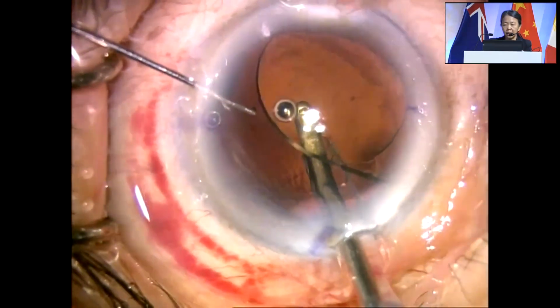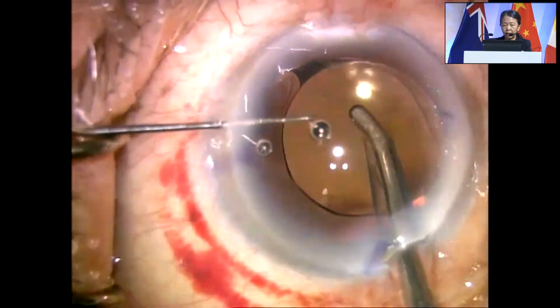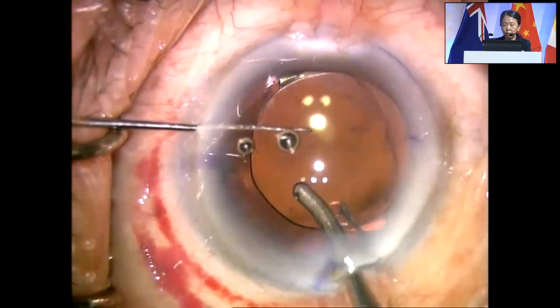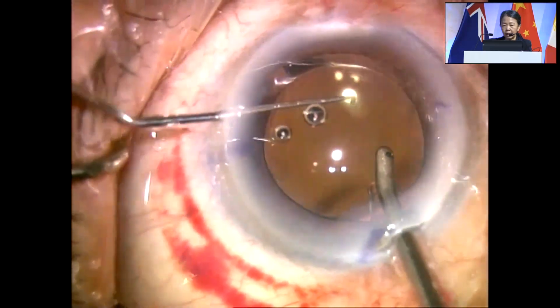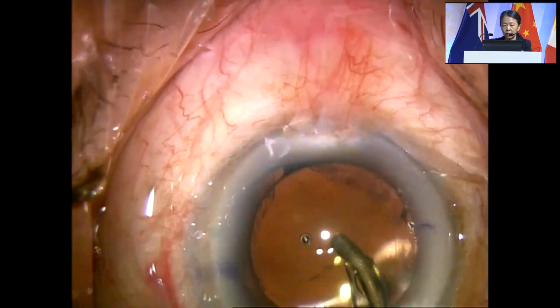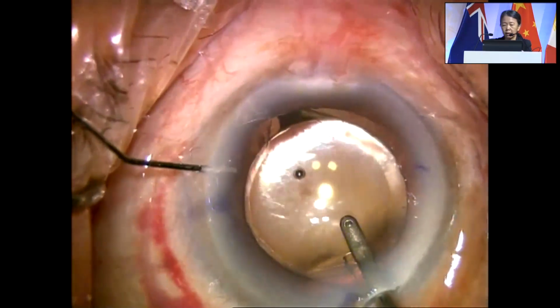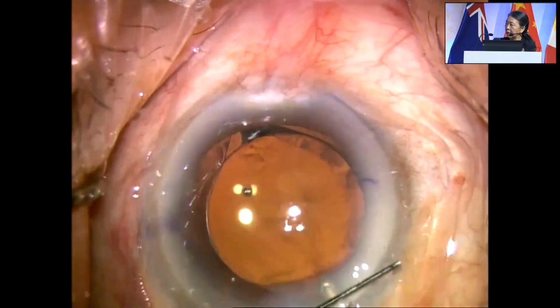I do think it does depend on your haptic design, but I have used the Alcon platform for many years in my practice, and I did not see any movement even with any capsule change. You want to comment on this, Dr. Titiel or Ramamurthy?